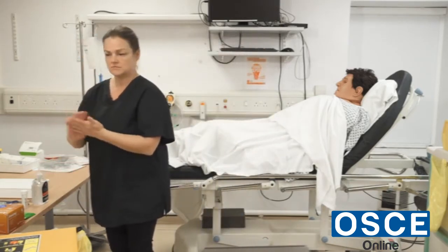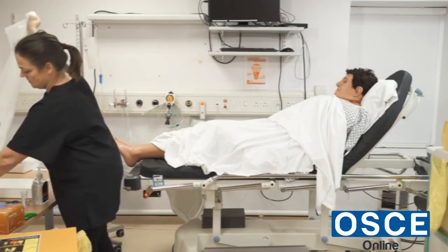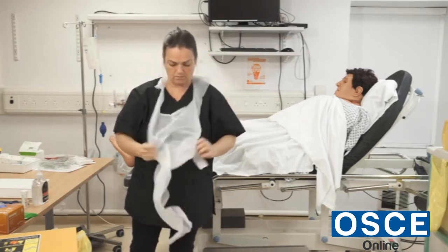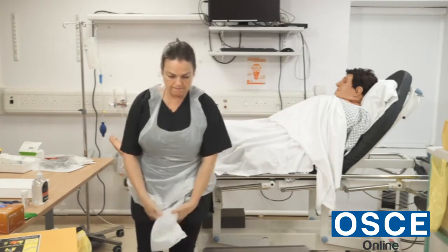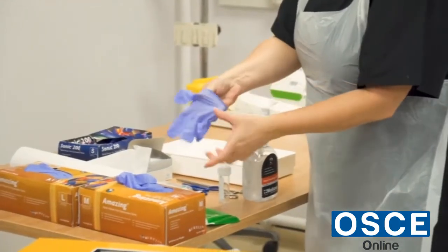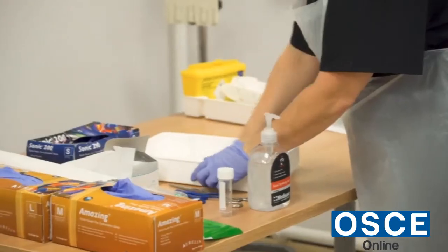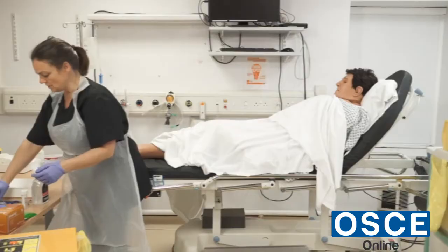When I leave the patient area I would again gel my hands quickly. I would assume this tray has been washed with soap and water in the past 24 hours. I'll put some gloves on just to protect my hands while I clean the tray with alcohol wipes — just a quick clean — and that will go in the clinical waste.